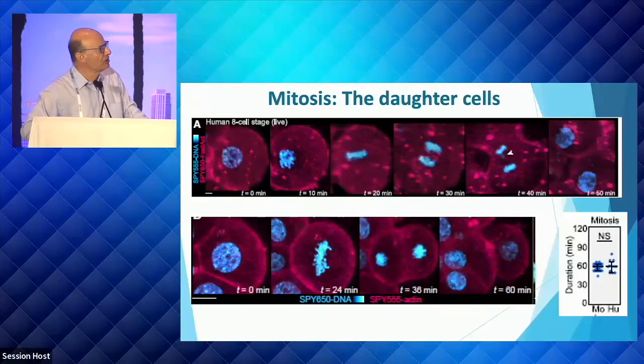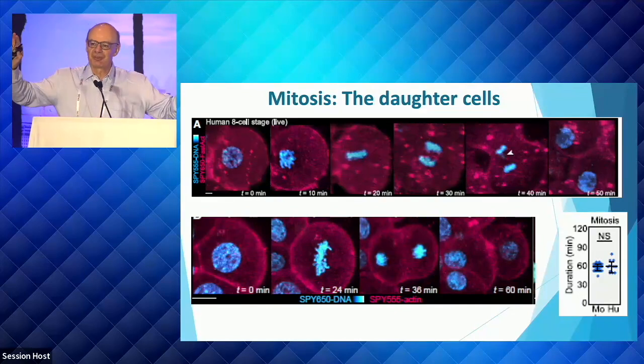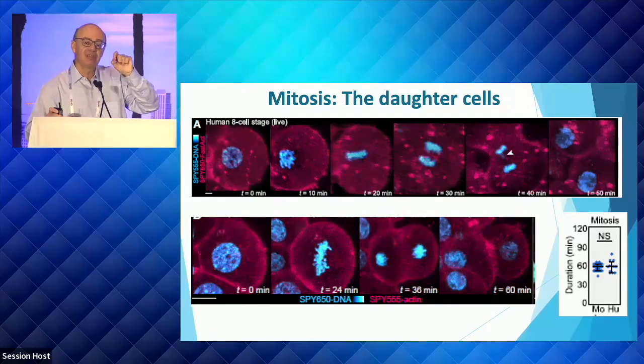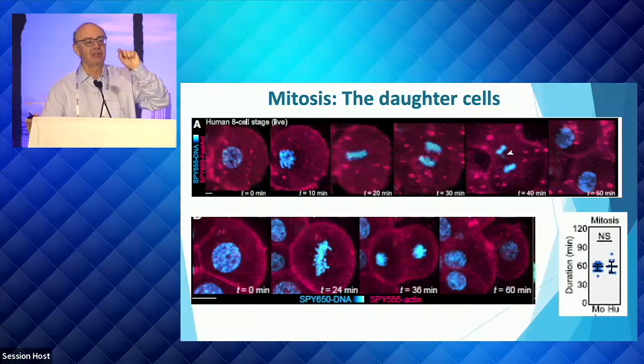So we're learning a lot of things, and obviously the cool thing we can look at is mitosis, and if you track mitosis, you could see very interesting things. We can follow the beautiful chromosomes segregating, but if you look at the last one on the second, the top second right, you can also see some chromosomes lagging. And obviously we know how embryos are bad at being euploid sometimes. But we can visualize chromosomes lagging when we look at these technologies.